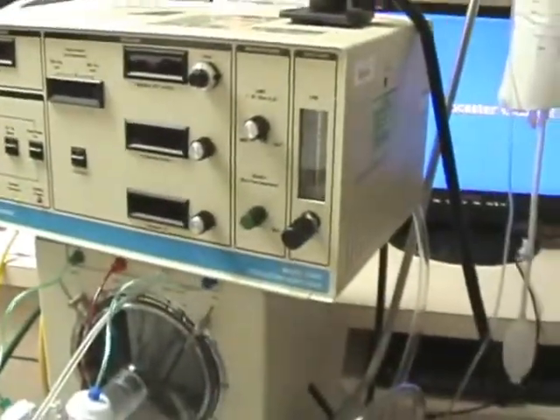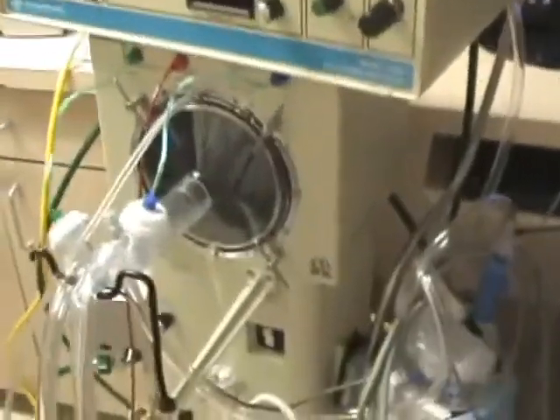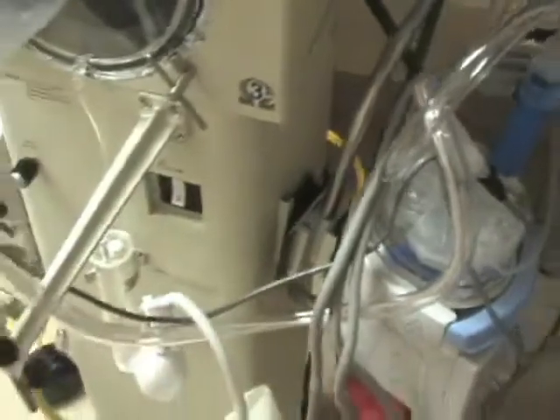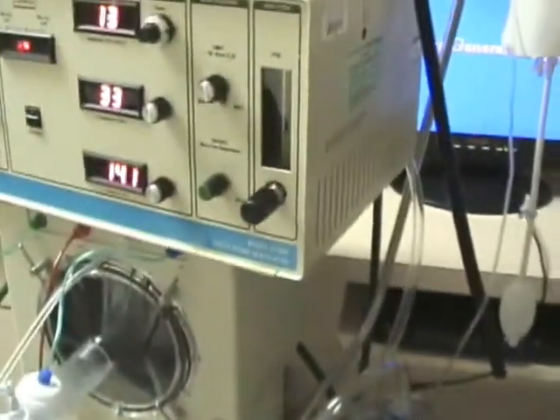This is the Sensormedic 3100A. Power button is down there.